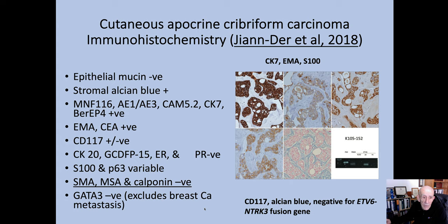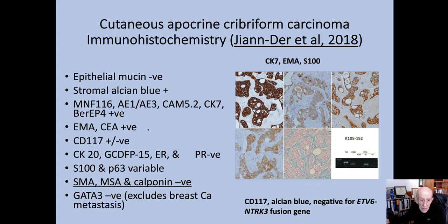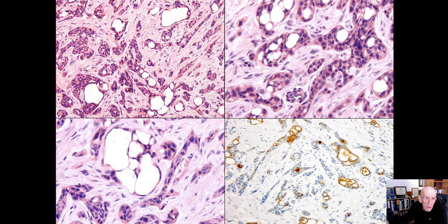For immunohistochemistry of apocrine cribriform carcinoma, the most useful marker is probably GATA-3: if it's negative, you've pretty well excluded a breast carcinoma. EMA and CEA will help pick up glandular differentiation, though it's so morphologically obvious I'm not sure you'd need it. I'm much more concerned about whether it's primary or secondary. Here's another case from Eduardo Colongi — it looks like an apocrine carcinoma, not desperately pleomorphic, with a lovely cribriform field, and EMA positive.